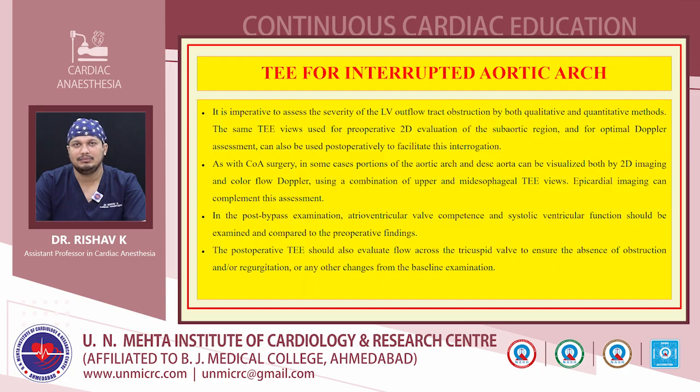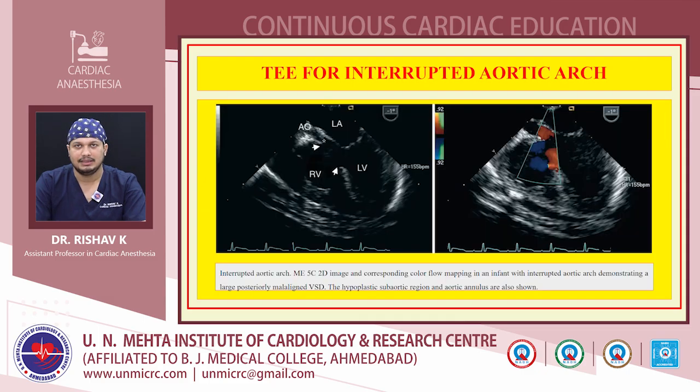In the post-bypass examination, we have to examine the ventricular function as well as the atrioventricular valve competence and compare to the preoperative findings. The post-operative TEE should also evaluate flow across the tricuspid valve to ensure the absence of obstruction and/or regurgitation or any other changes from the baseline examination. So these are some of the relevant TEE views.